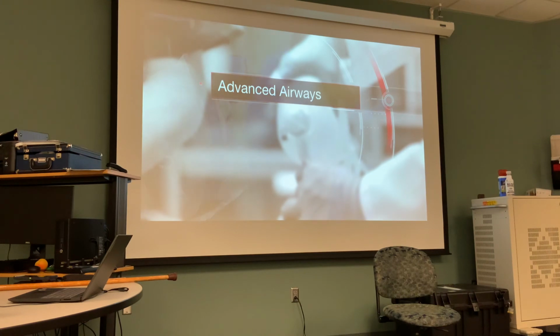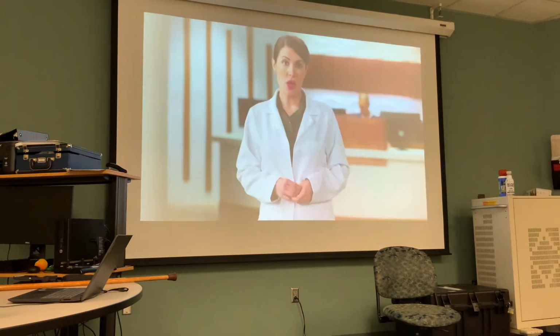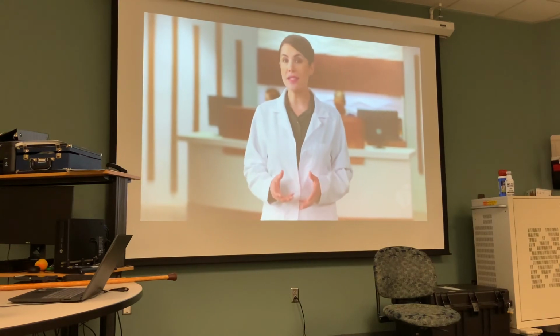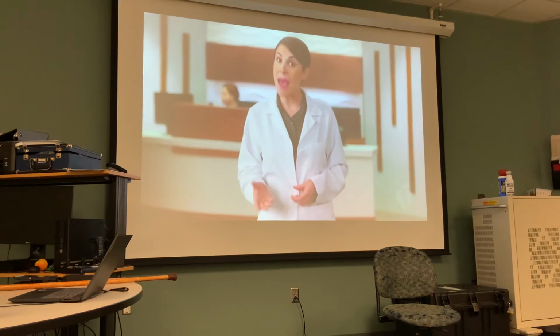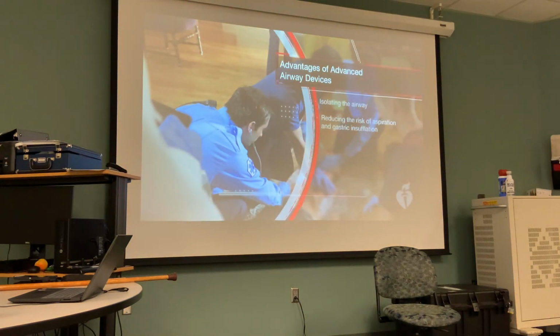There are several possible indications for insertion of an advanced airway. These include difficulty providing effective bag mask ventilation, patients with actual or potential airway compromise, particularly with long transport times, or the need to isolate the airway. With careful attention, trained healthcare providers can use an advanced airway to safely provide ventilation that is as effective as bag mask ventilation. Advanced airway devices offer many advantages.